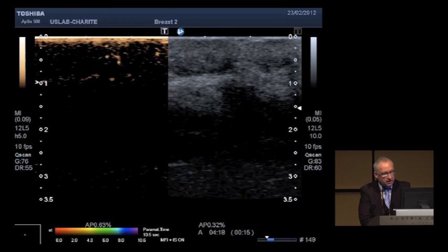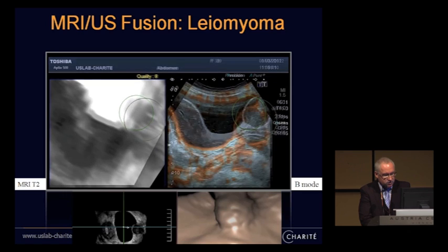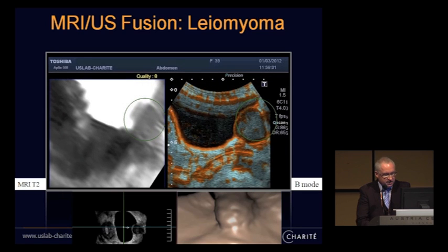This technology for fusion works also in terms of MRI scanning. On your left, MRI. On your right, high-resolution ultrasound. This is a round-shaped mass here, and this corresponds very well with this image. And you see here the impression of the bladder, very beautifully reconstructed in the fly-through way, acoustic structure quantification, and there's the same tissue in that lesion like in the uterus. It's absolutely comparable, and that's the key for the diagnosis.